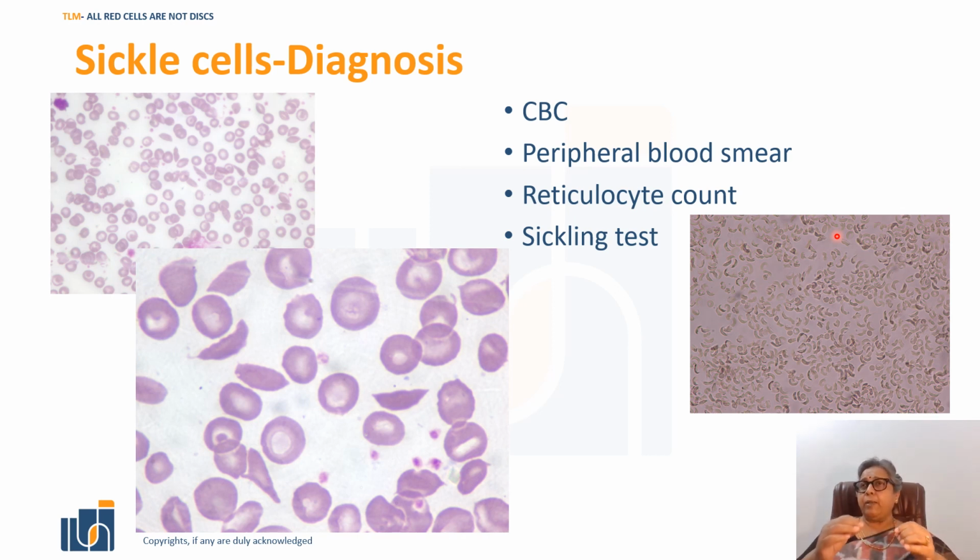And when you take an unfixed or a fresh specimen and mount it with a cover slip and look under the microscope, you will find plenty of sickle cells.